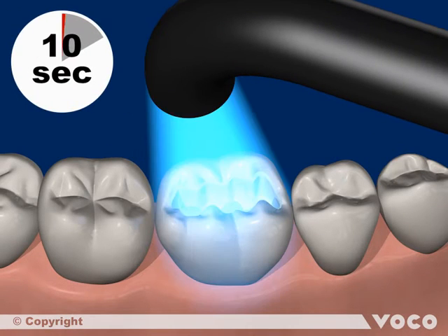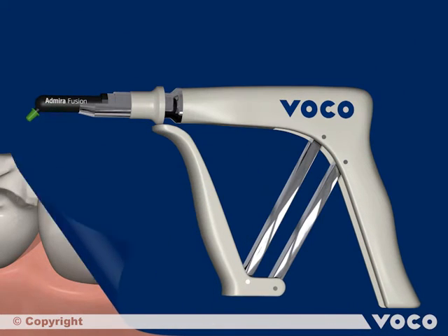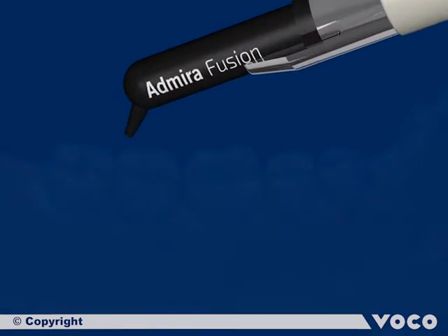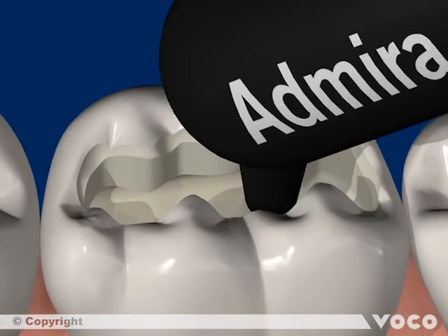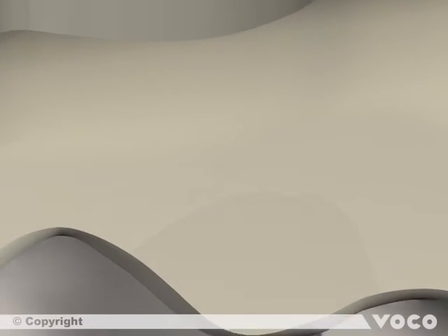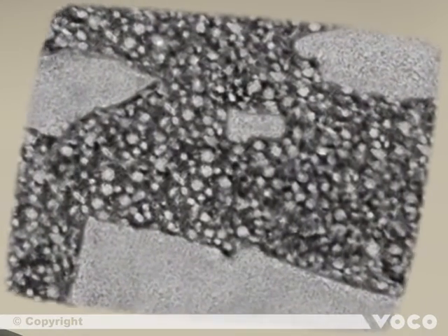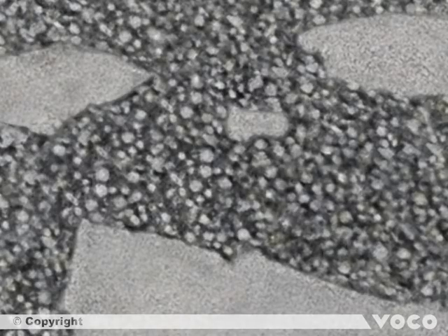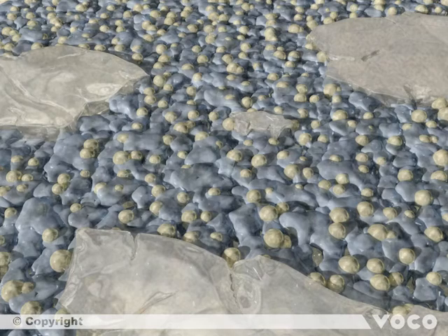10 seconds of light polymerization are necessary to cure the layer completely. The first increment of Admira Fusion is directly applied into the class 1 cavity and adapted. Before the curing process starts, we have a closer look at the inside of the material. With the help of transmission electron microscopy, it is clearly identifiable that Admira Fusion contains a mixture of different sized glass particles, nanoparticles and Ormocer resin. The colored illustration depicts the single elements more obviously.